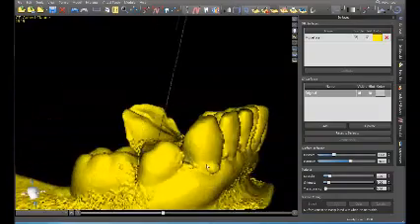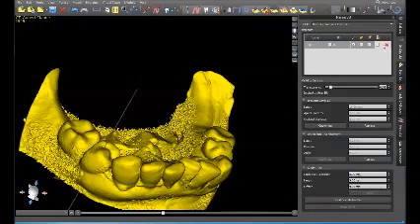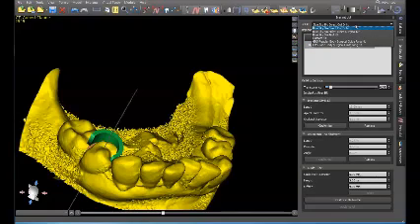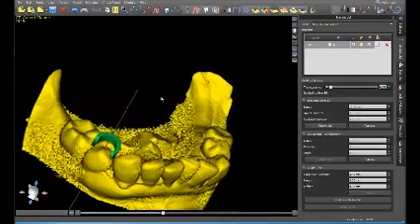So in order to do that, I'm going to make a guide on this. So what we'll do is go back into implant, turn on guide tubes, and this is selected for BioCut drills. What I like to do is use my pilot drill kit that offsets automatically to a 3.1. Changing it to the Blue Sky Bio pilot drill will change the outside diameter to a 3.1 that'll fit guide sleeve tubes that are 3.0, and the inner diameter is a 2.1 that fits a 2.0 drill.